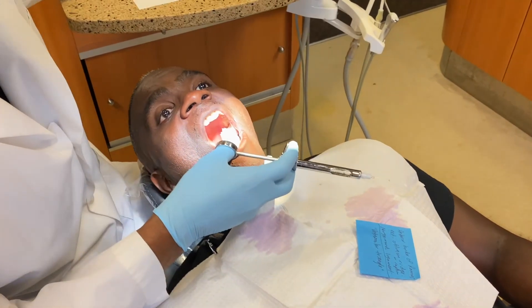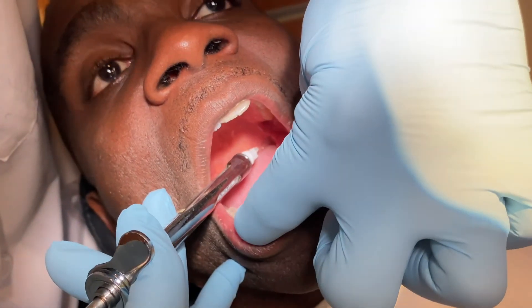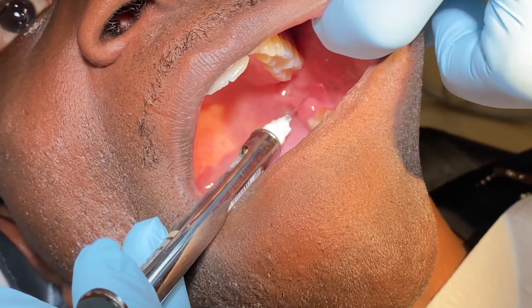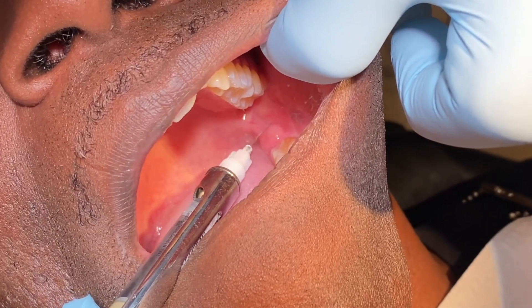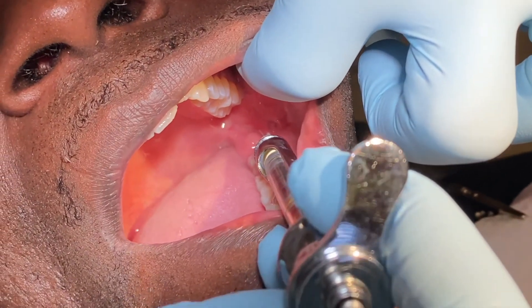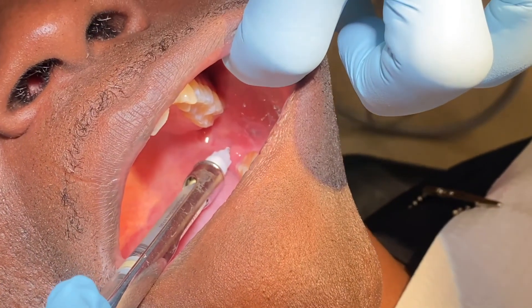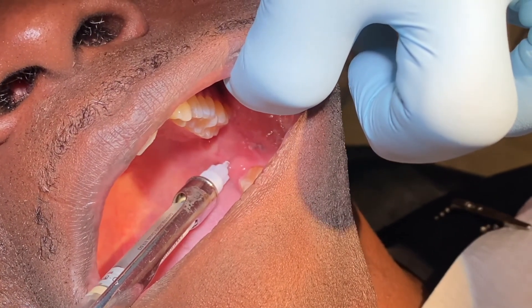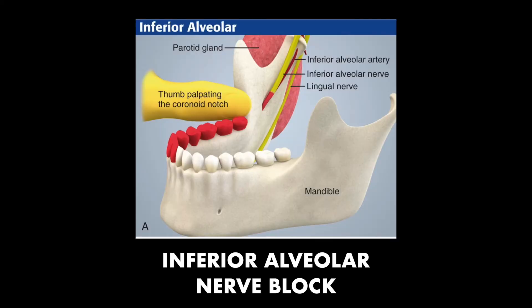I'll take the topical out. Here again, I'm going right to my triangle — coming in from the contralateral premolar side, going just slightly underneath the tissue. I'm wiggling his cheek just slightly to distract him, and I've injected just a little bit. I stop injecting, come to the ipsilateral side to go along the ramus, advancing almost to the hub, then come back to the premolar side and inject the remainder of the carpule. Remember to aspirate before you infiltrate. And that is the inferior alveolar nerve block — pretty painless.